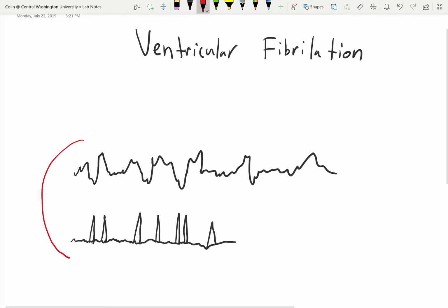So if you notice, your P wave, right, is about yay big, and the QRS is much larger, and that's because the ventricles are bigger, and so there's more electricity there. So we get what we call amplitude. There's more amplitude, which is why the QRS is bigger than the P wave. And that's the same deal going on right here. In AFib down here, you have squiggly nonsense, but it's smaller because there's less electrical activity since it's in the atria. And in VFib up here, it's bigger. It's the same kind of chaotic, disorganized, scribbly lines, but it's bigger.